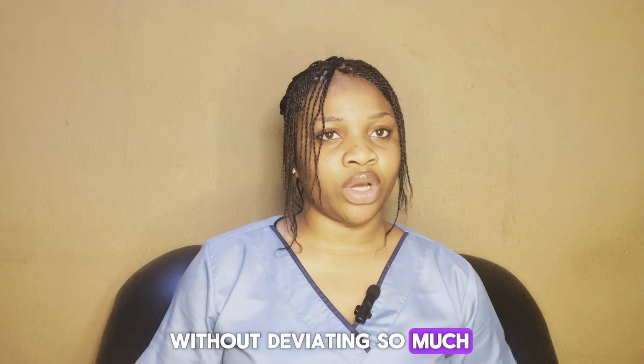So you explain it to the patient. Then you explain that there are some risks that might take place while doing the procedure. There can be infections, which can be minimized by the aseptic non-touch technique, hematoma, and vein inflammation. So you need to inform the patient and educate them that these can be risks.